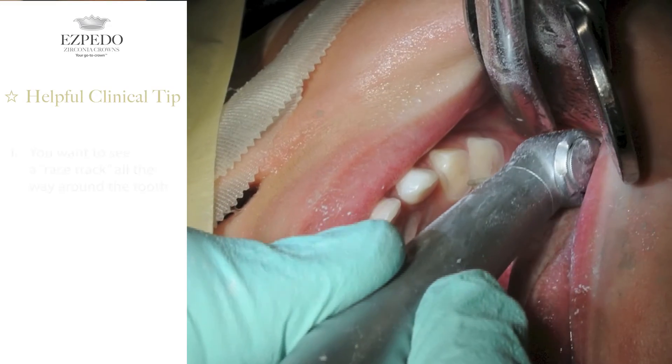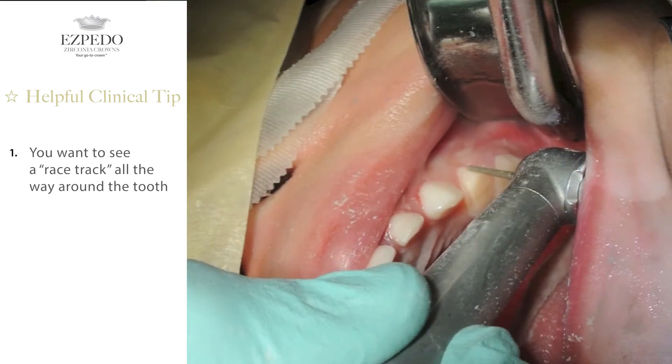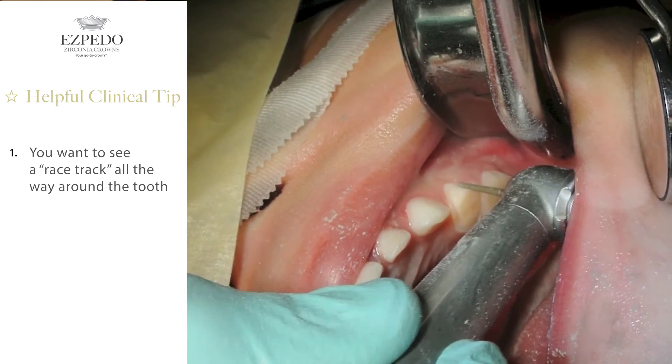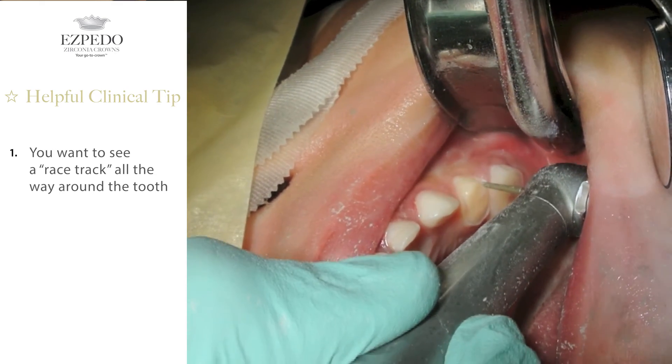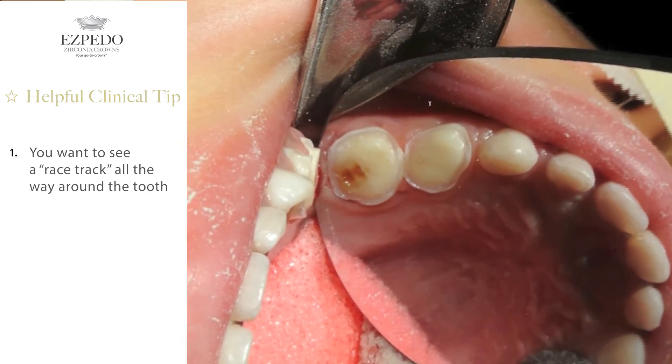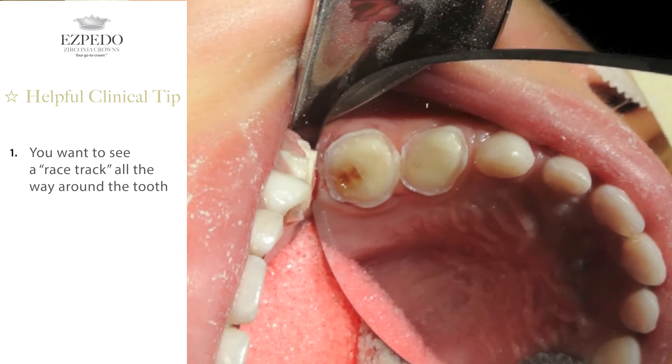Let's take a look at the big picture here. The prefabricated zirconia crown prep is a cylinder. The quicker you learn to produce the shape repeatedly, the quicker you'll be able to achieve predictable results in less than 5 minutes. You want to see what I call a race track all the way around the tooth. If you do not visually see the race track all the way around, the car will fall off and you may not have enough reduction in that area. Trying to figure out where it is under-reduced later will cost you valuable chair time. If you follow this step, it will work every time.